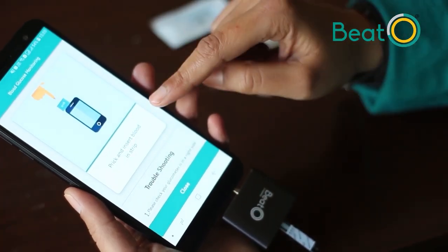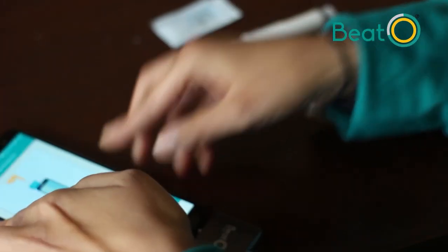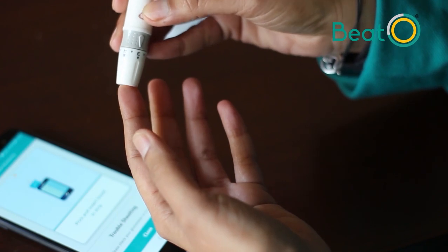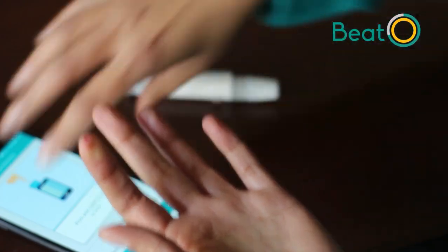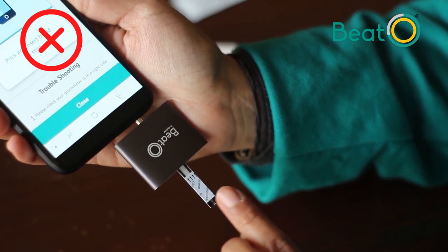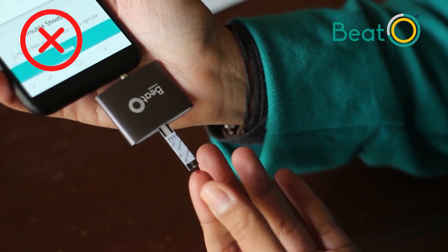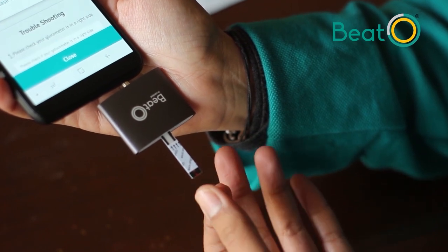After inserting your strip, your screen will ask you to apply blood to the strip. Take your lancing pen, place it on your fingertip, and press the trigger button to take some blood. Squeeze your finger to get a tiny amount of blood. Apply the blood to the strip — make sure you don't apply it on top or at the bottom; apply it at the edge of the strip. The strip will automatically suck in the blood.